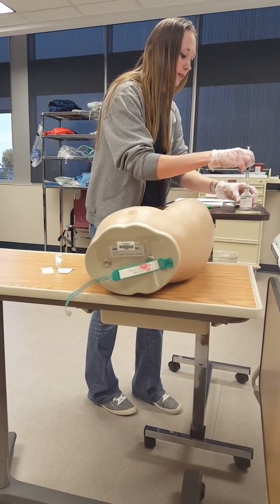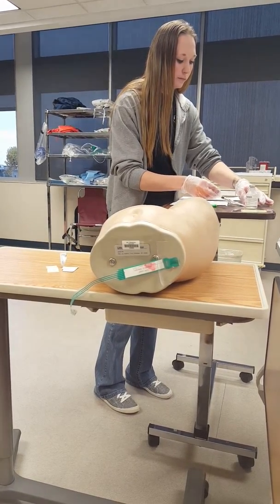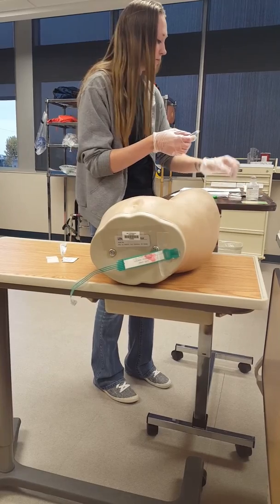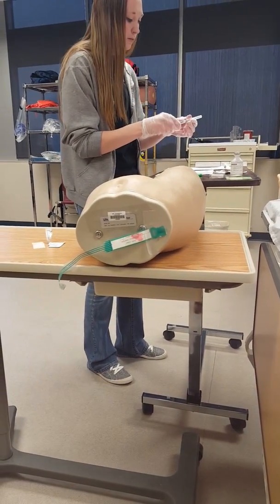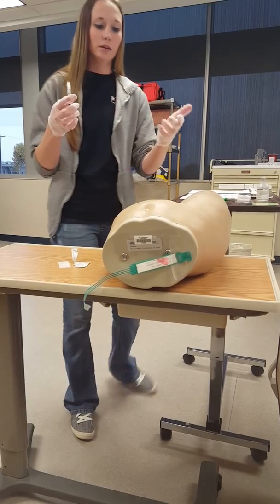Okay. Then I would put my cap back on. And I'd take this one off, and I would get my needle. Okay. Now my site is clean.